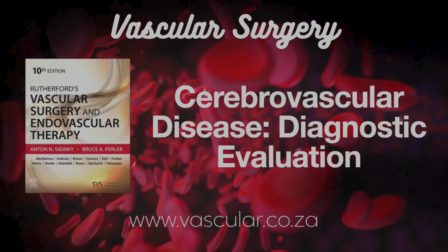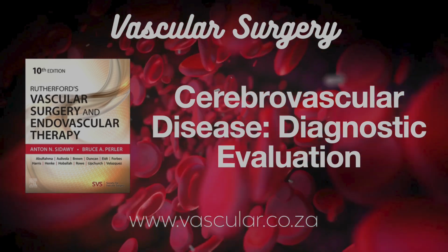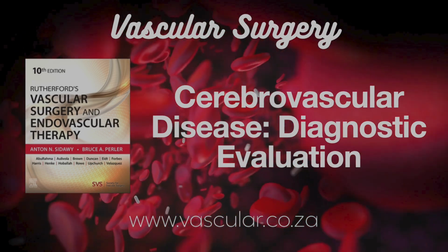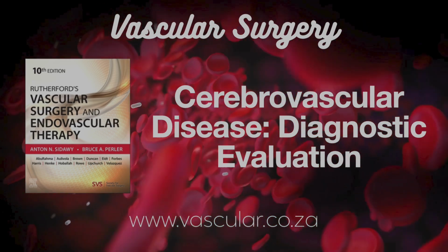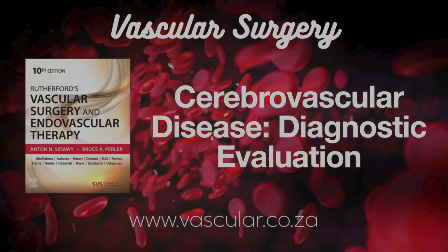But MDCTA is really vital in trauma. Right, vital. Because it's fast and in one scan gives you the whole vascular picture from the chest up into the head, plus shows any associated bone fractures, soft tissue damage, or brain injury. You can do it even on ventilated patients. It's incredibly efficient. And DSA in trauma?